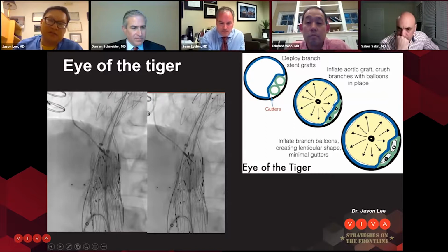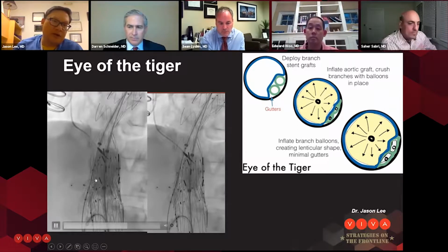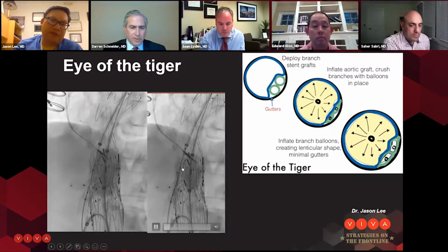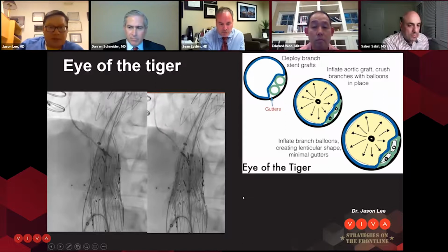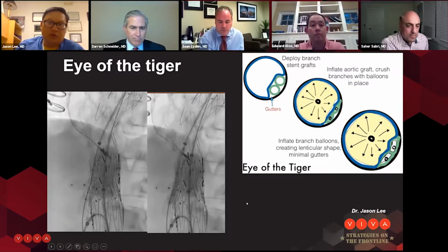He had this idea, which I thought was very clever, where you take a smaller balloon after you've inflated it, and then it collapses it down more to an eyelet, if you will. And so here in this scenario, after I've deployed the 779 VBX, I crush it. And then in this video, I inflate a 4 millimeter balloon and then crush it and then inflate it against the larger balloon. And it creates kind of an ovoid shape, which you'll see on the CT scan here. This is a nice technique, particularly for a single snorkel or even for a double snorkel. You can make these more oval shape.